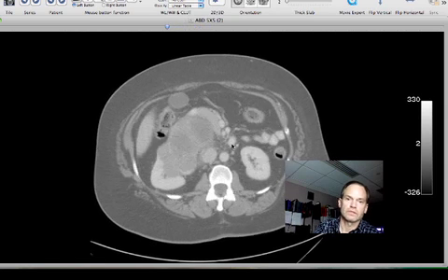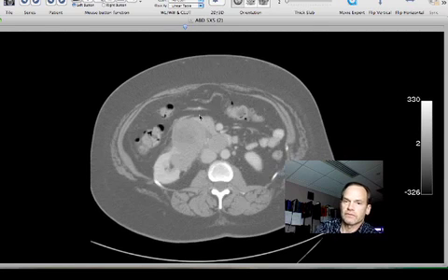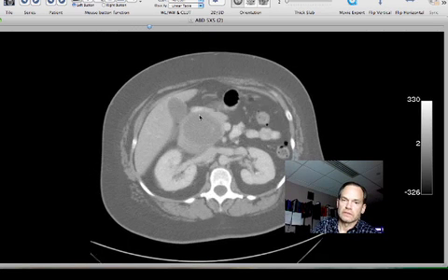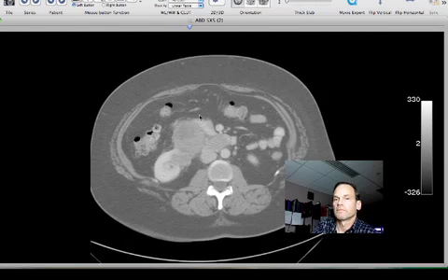portion sweeping across. So this tells you that the second portion of the duodenum is displaced anteriorly, and you would not typically expect that from a pancreatic mass. The kidney is positioned so that it could well produce anterior displacement of the duodenum.